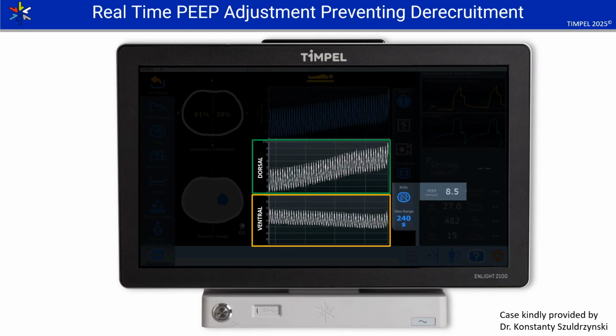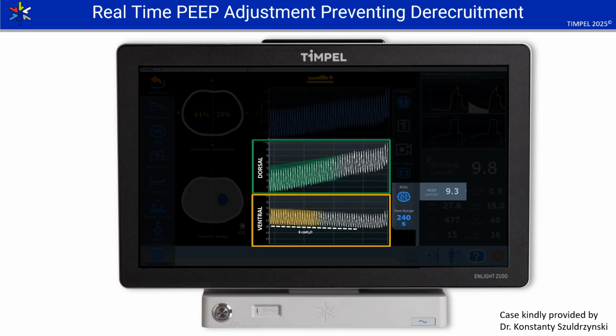This is a real clinical case. Here, we observe differences in regional lung mechanics. One lung region, here dorsal, recruits, while another, here ventral, begins to close. It sounds a bit strange, right? This situation was recorded after proning the patient.